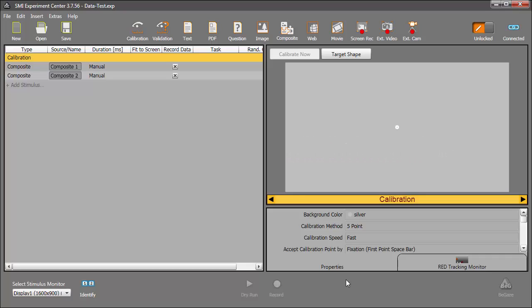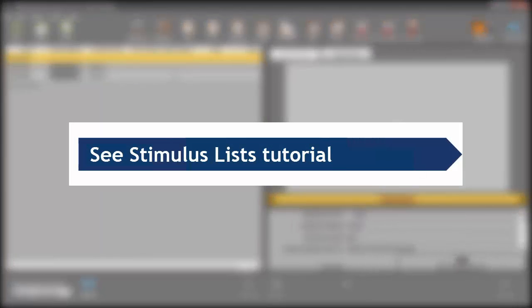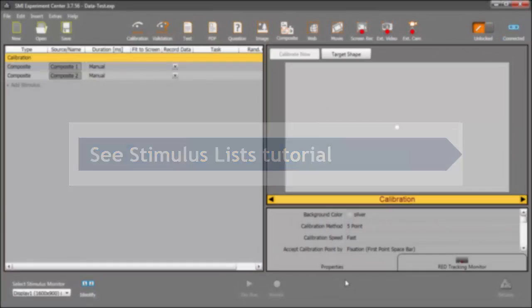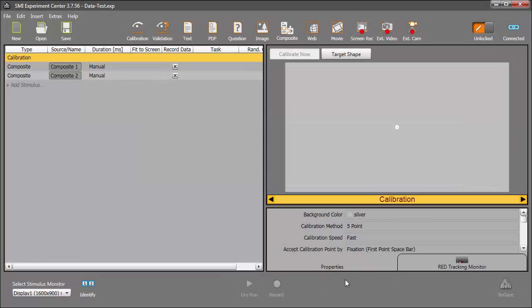Obviously, these are very simple experiment examples. Much more complex experiments can be created for saccadic and smooth pursuit paradigms, either using the techniques I just illustrated, or by creating a stimulus list in a spreadsheet, using Excel or an open source program, for example. And then, once it's created, importing it into Experiment Suite. Let's take a look at how that works.